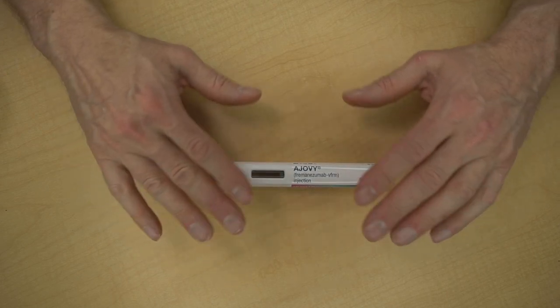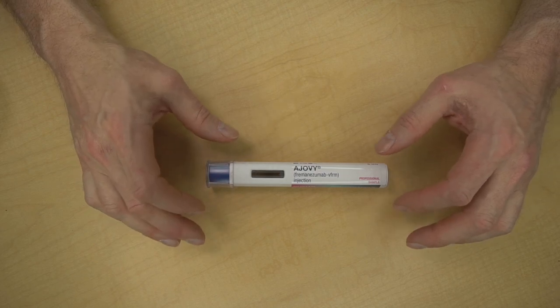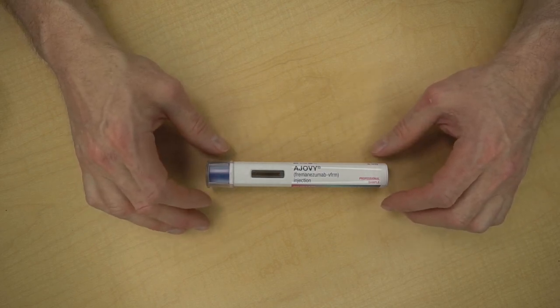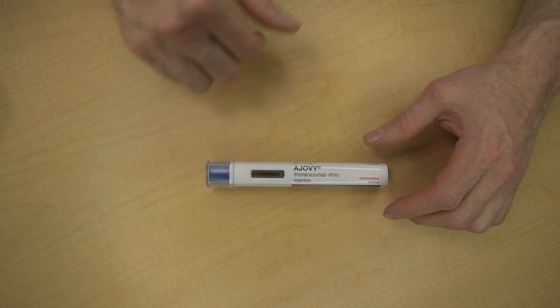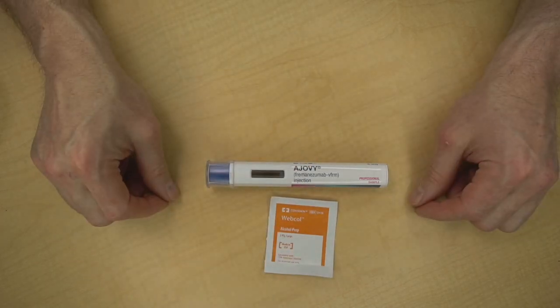Inject into healthy skin. That means no rashes, birthmarks, scars, tattoos, or stretch marks. And avoid injecting into an artery or a vein. Once you've found your area or areas, clean them with an alcohol swab and let dry.